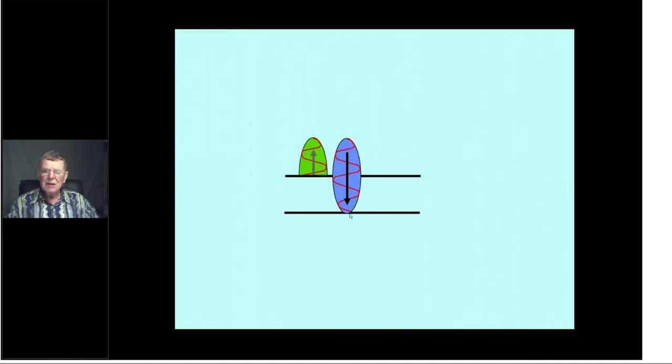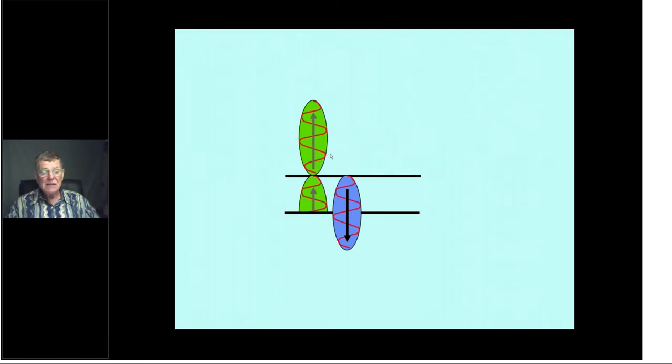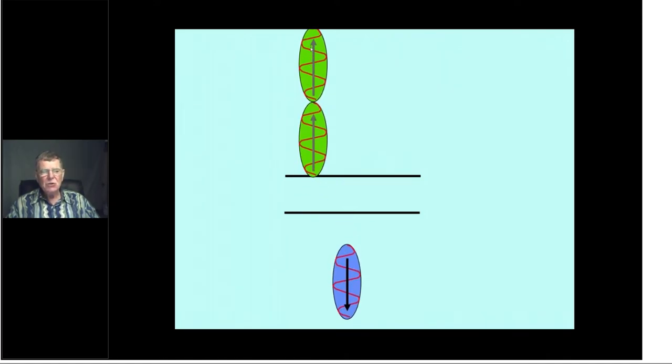happy. But the pulse has now started to hit the second interface. Okay, so it's still going through the first one and it's striking the second interface. It will start to return an echo from that interface. So as it moves through, here's the echo from the first interface, and now here's the generating echo from the second interface, and there the 2 echoes from the 2 interfaces moving back to the transducer. I ask you the same question. Are those echoes clearly separate?